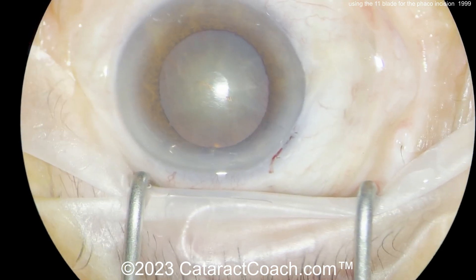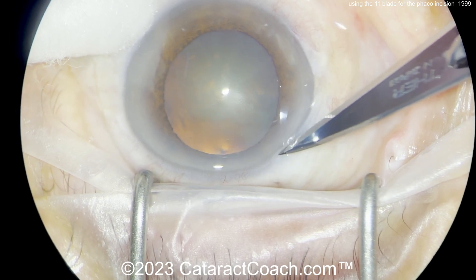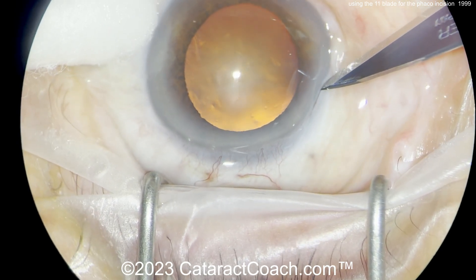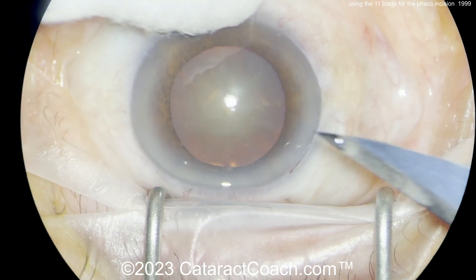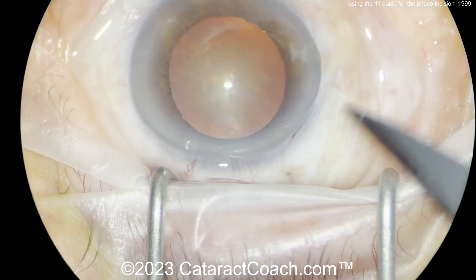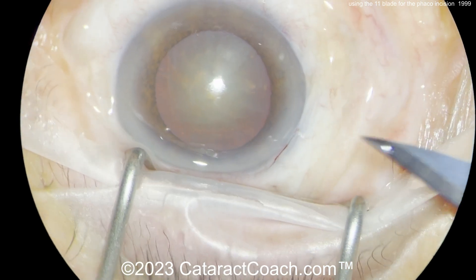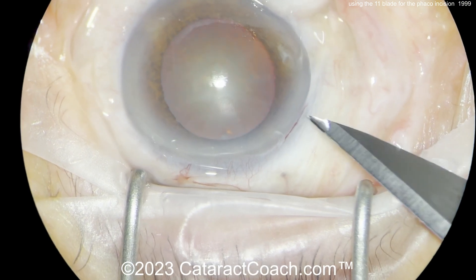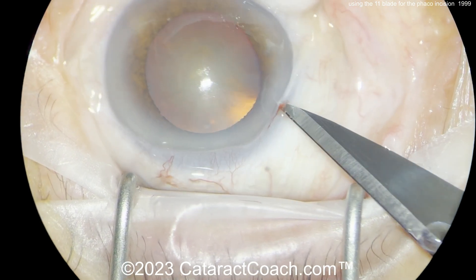This incision has a little bit of a shorter tunnel length than the first one — I think the first incision was the one I preferred, but even this one's good. Look — nicking the limbal vessel with a little bit of a groove there. That groove is going to help you delineate where to start, and nicking the limbal vessels means the incision is going to seal beautifully in the future.